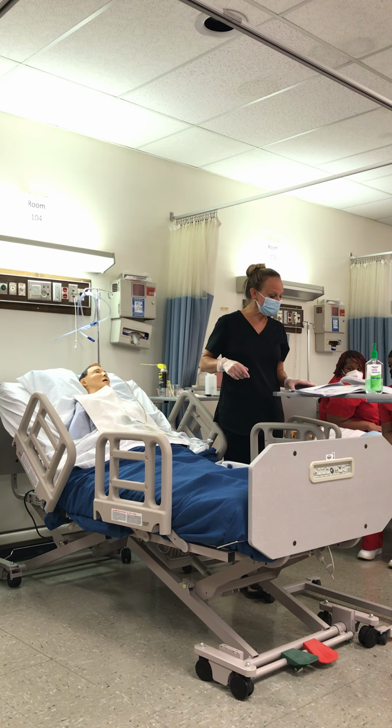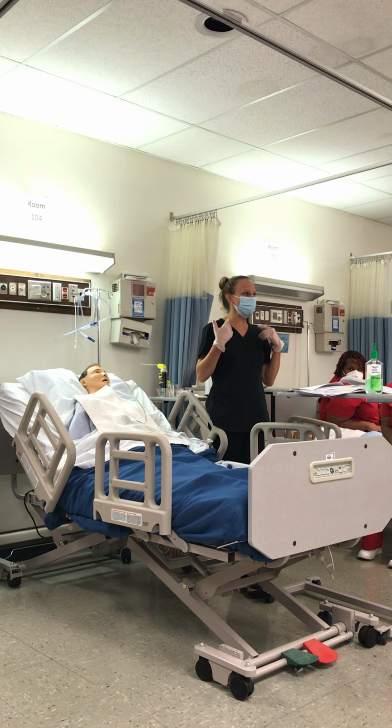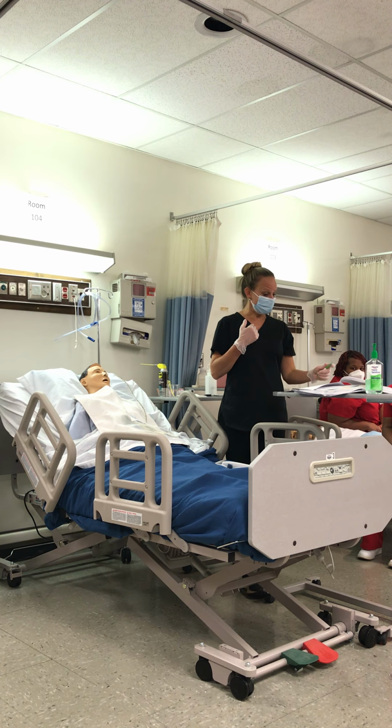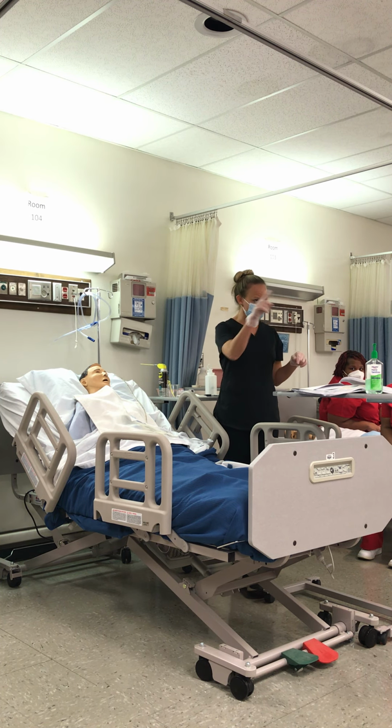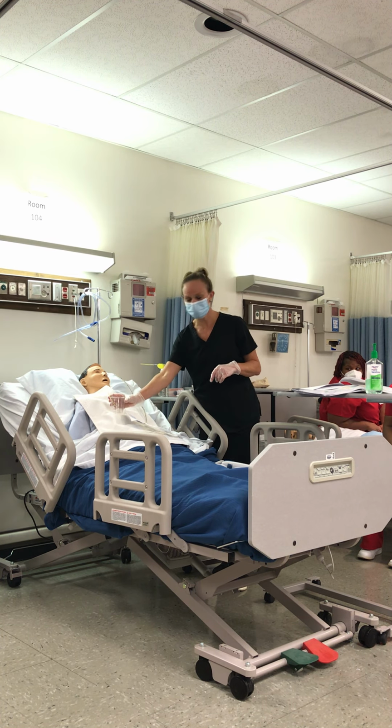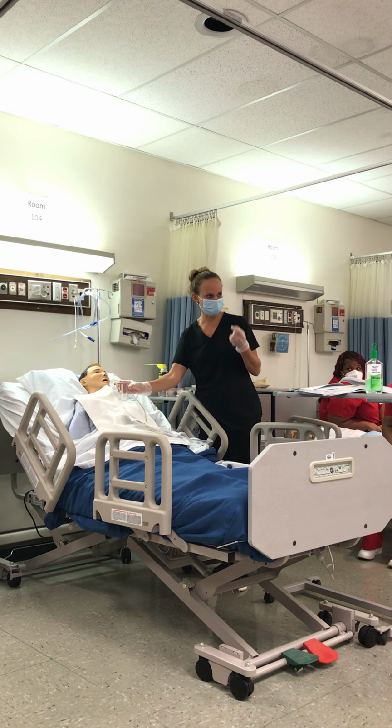So you're going to look in the back of the throat, and now what do we want to tell the patient to help advance this tube? Swallow. That's one thing, but also lower the chin. That puts the anatomical position in better for that tube to be passed on down, okay? So tilting that head down. And then also you said taking sips, okay? So here's your cup. This gives them something to do. Hold your cup, take little sips of water.